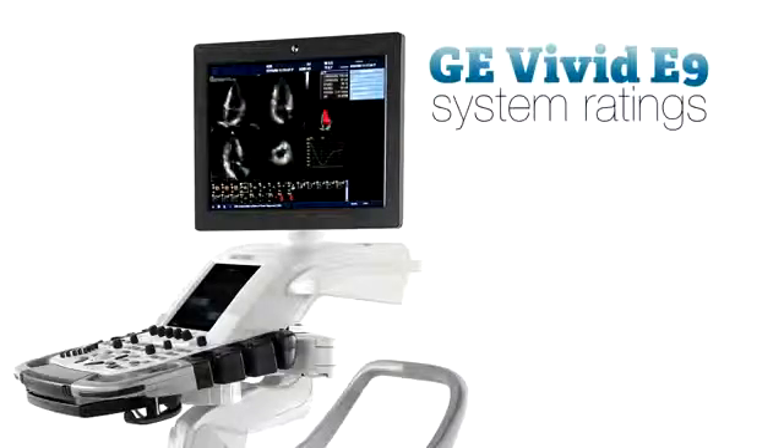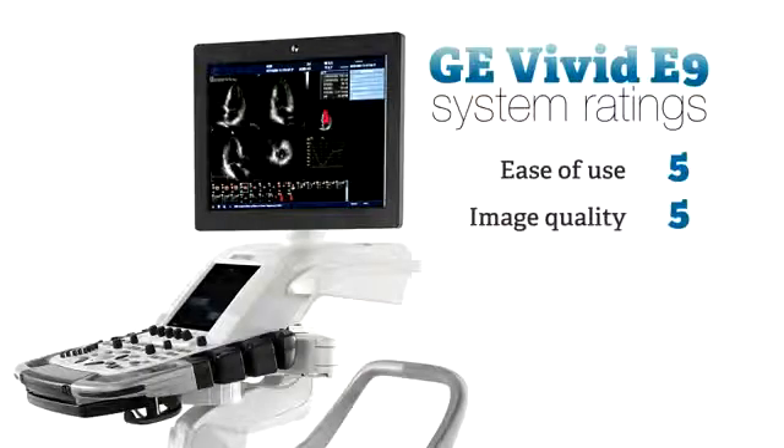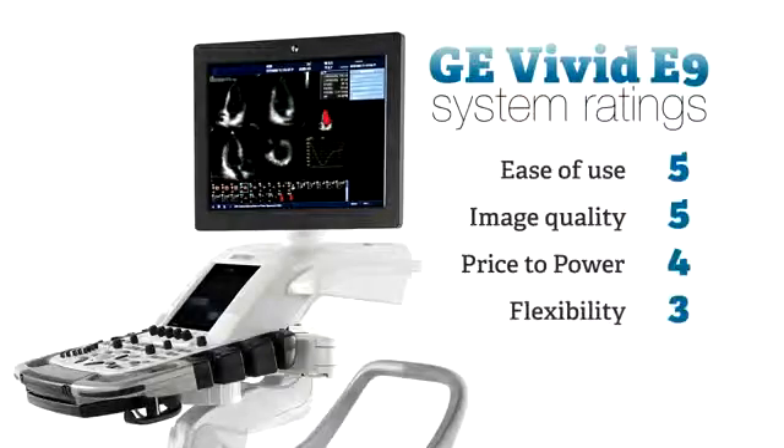So how do we rate the Vivid E9? For ease of use, we give it a 5 out of 5. For image quality, a 5 out of 5. For price to power, a 4 out of 5. For flexibility, a 3 out of 5. And for feature depth, a 5 out of 5.